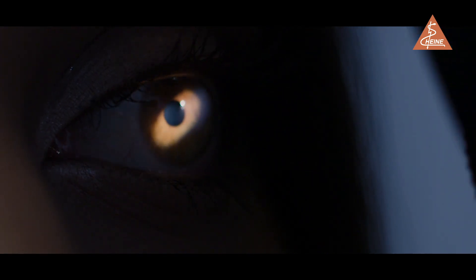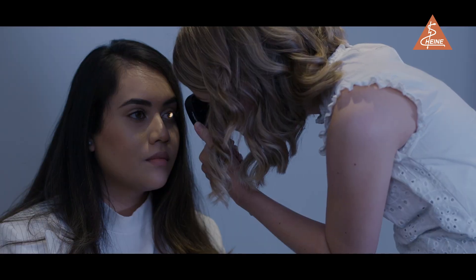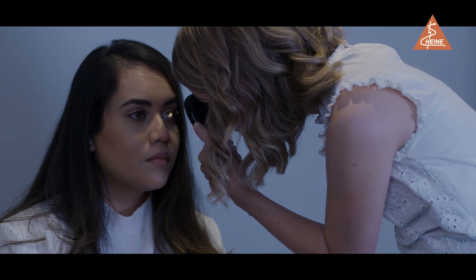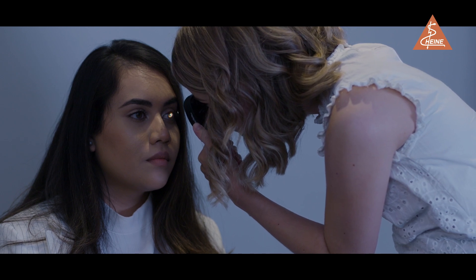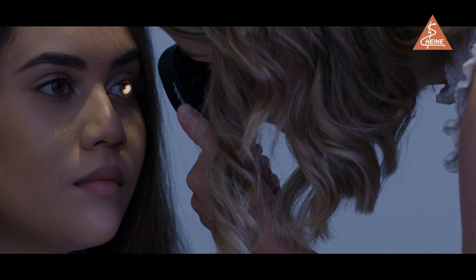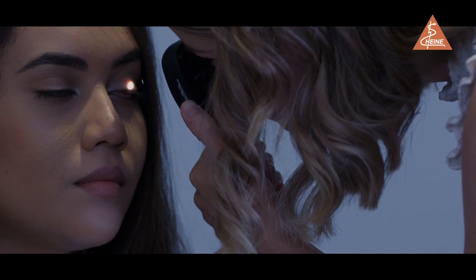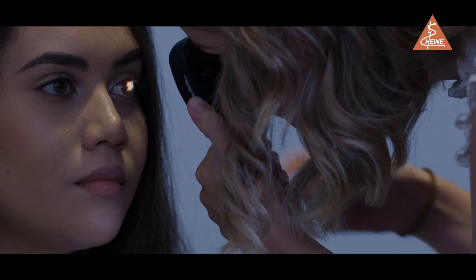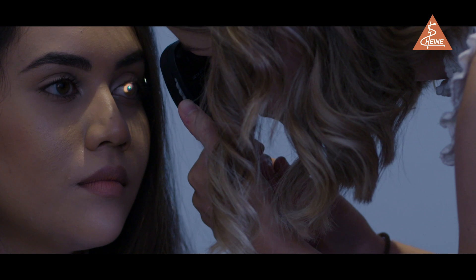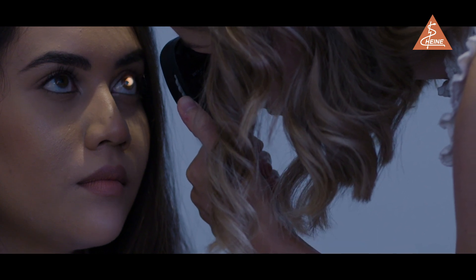Once here, pay particular attention to the disc's colour, contours, and the cup-to-disc ratio. Once satisfied with your disc examination, ask the patient to look in eight positions of cardinal gaze to examine the mid-periphery.